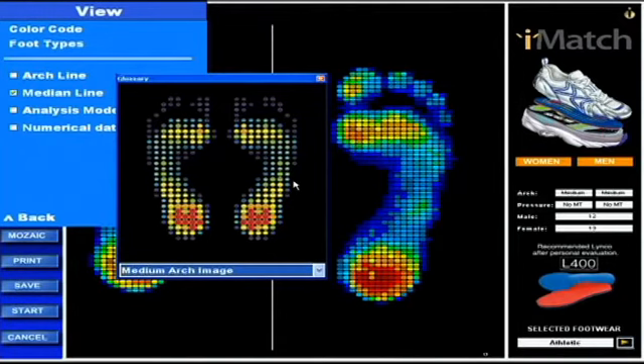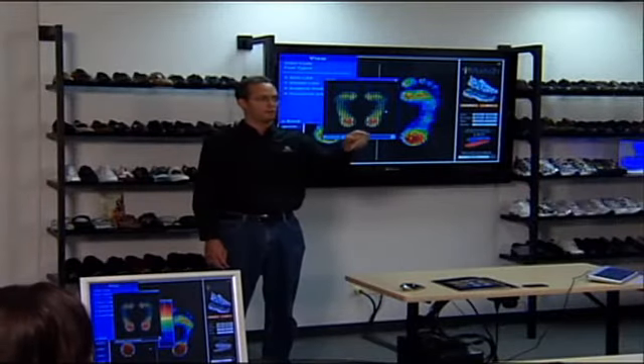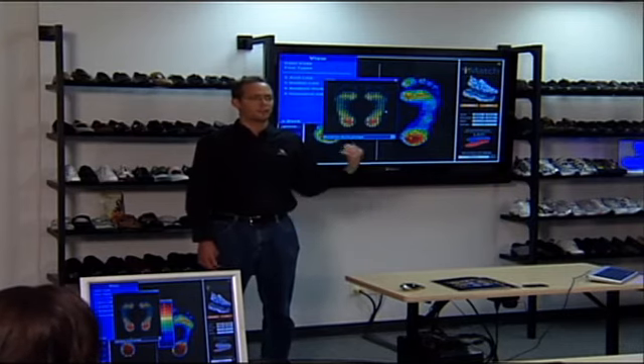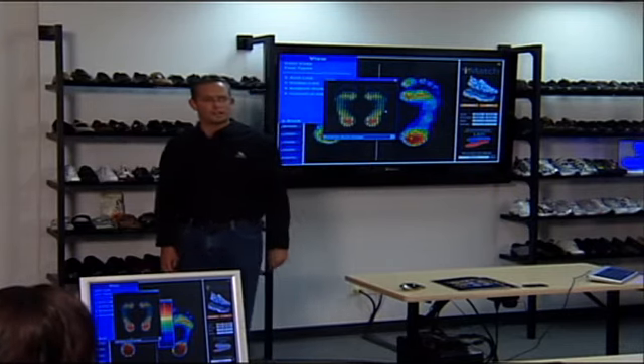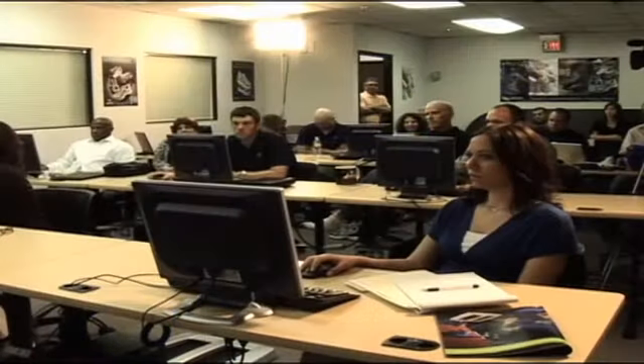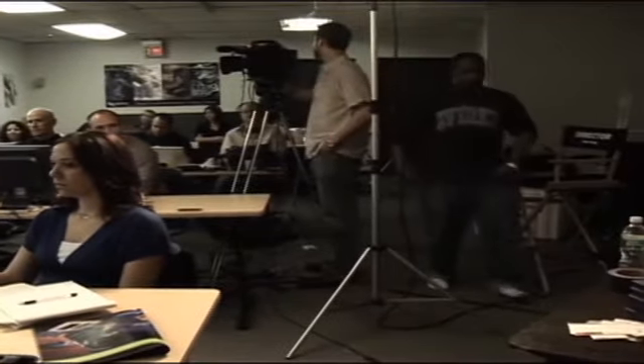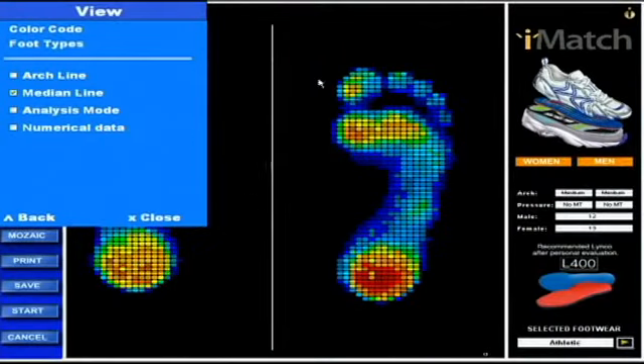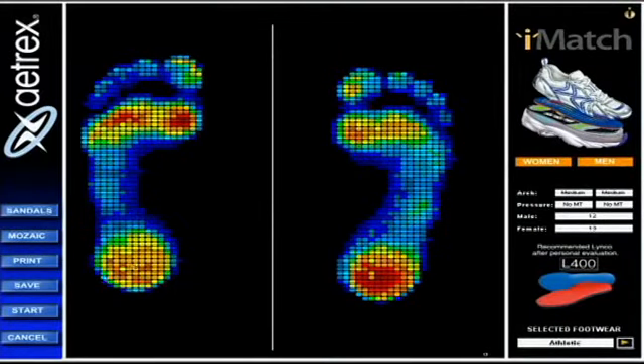Anybody here have low arch or high arch feet that we can use? Glenn, you have high arch. Joe, you have low arch. Joe, why don't you come over — let's show everybody a low arch, and Glenn, yours is high — we'll get yours on there too. I want to show on the big screen what a low arch foot would typically look like.